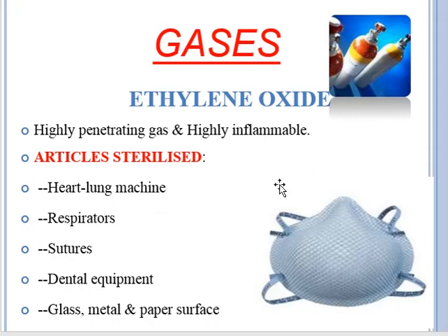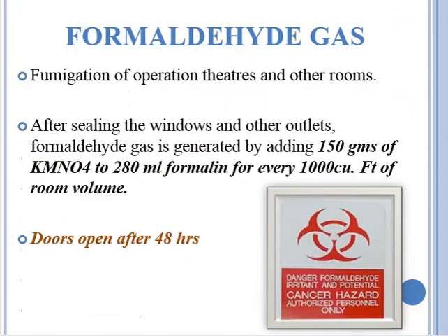It is a highly penetrating gas and highly inflammable. Different articles sterilized include heart and lung machines, respirators, different sutures, dental equipment, glass, metal, and paper surfaces. And in gases, the next is formaldehyde gas.